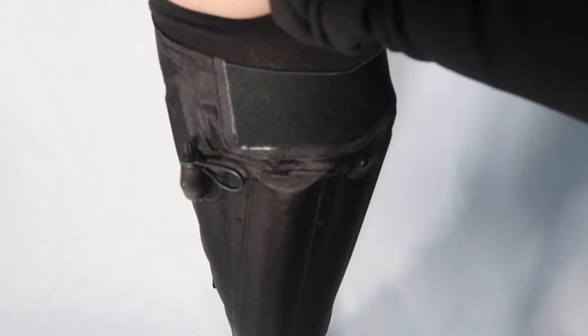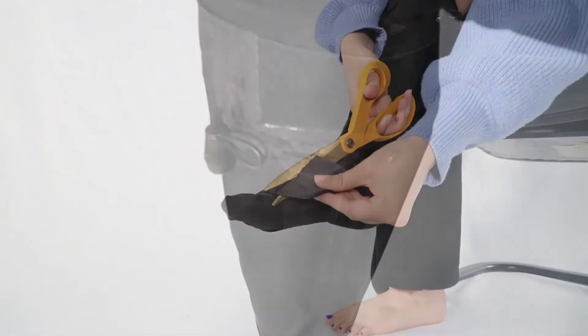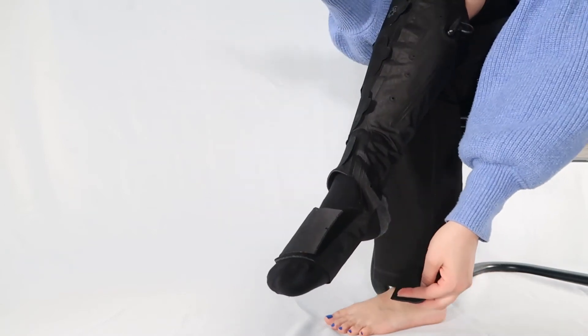The AeroWrap is properly aligned if the elastic strap is hugging the back of your calf. If the foot strap is too long, it can be trimmed. Please refer to the instruction booklet for further details.